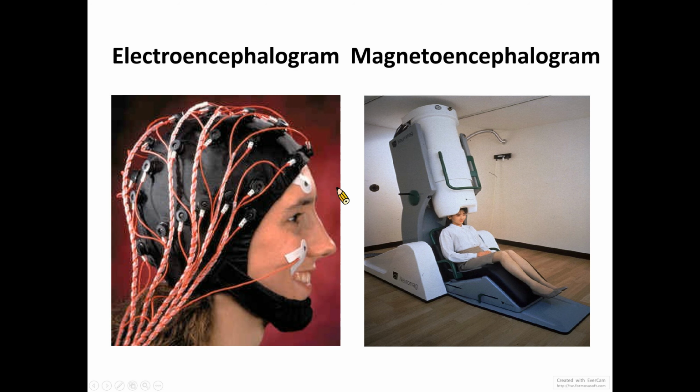That is why we can use the surface electroencephalogram, with many electrodes attached to the scalp, but also the MEG device to non-invasively detect the magnetic field changes in the brain and determine the electrical activities underlying that region.